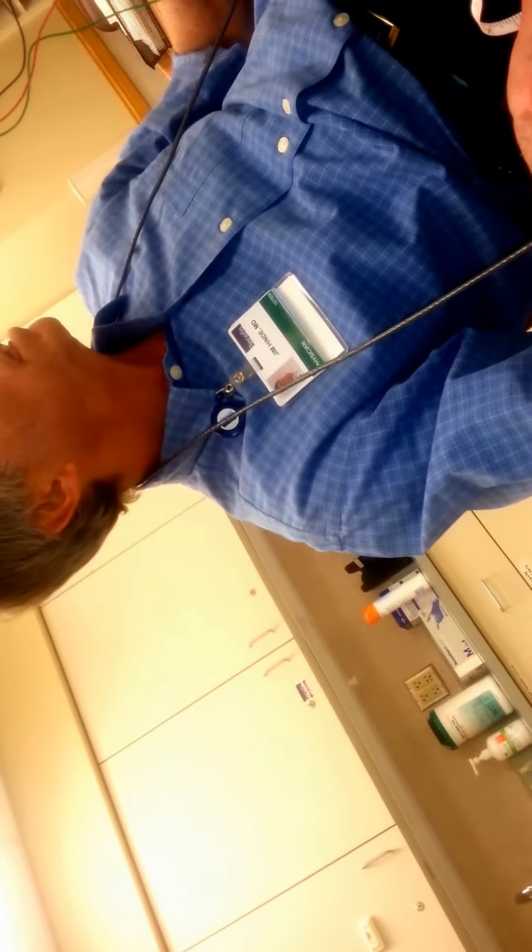One more. Good. We want to make sure we get the signal. How does it feel, these shocks? What does it feel like? Kind of painful. Okay, it's kind of weird too, because your arm moves without you trying to move it. Right, bypassing your brain and going right to your own electrical wires and putting current into it so that your muscles twitch. So that's 102 millimeters, and we want a speed of 50 or above, and we get 73 and 61 for those two segments.